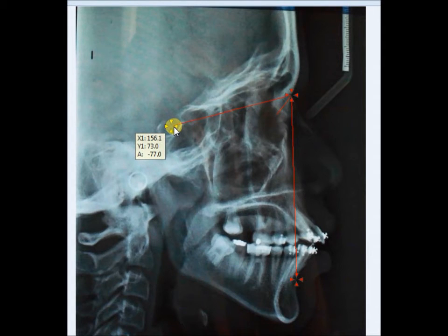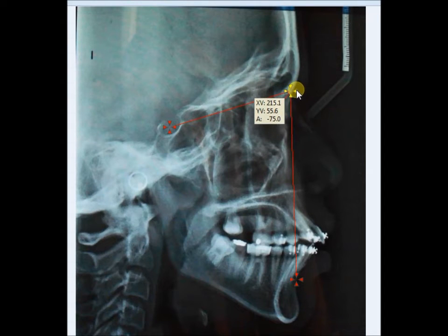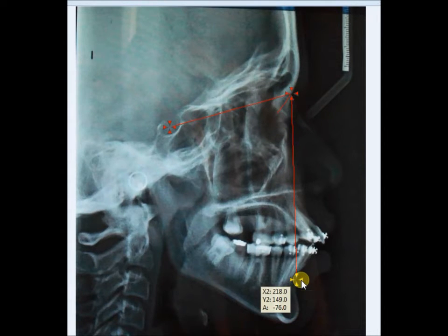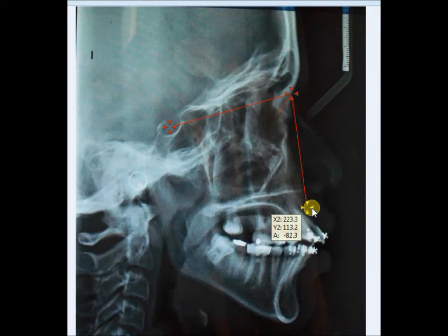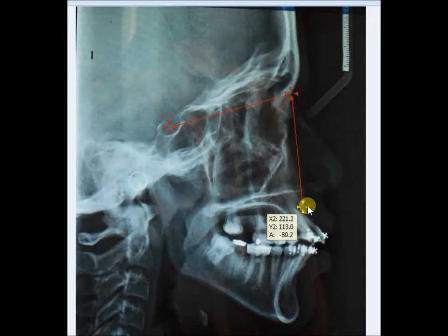I'm taking this and placing it at the S point. The next point — it becomes yellow, left-click and drag — at the N point. Again it becomes yellow, left-click and drag at the soft tissue A point. Now you have the SNA angle; it shows as 80.2 degrees. The minus indicates the internal angle, so you don't take the minus — it's 80.2, which is the SNA.